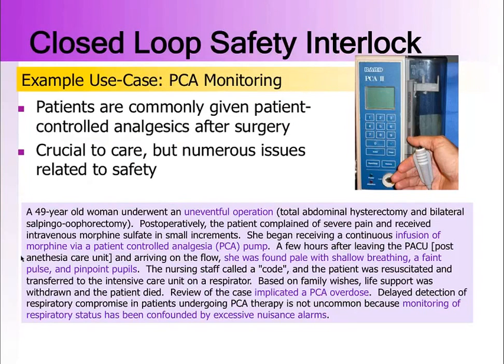There are even situations that you might not think of, called PCA by proxy, where the patient's family in the room sees grandma grimacing and not feeling very well, so they push the button for her, right? And so you can get in a situation where more opioid is given than you would like. These pumps include some basic safety features, like you can only press the button every so often, and there's a limit on how much you can infuse over an hour and so forth.